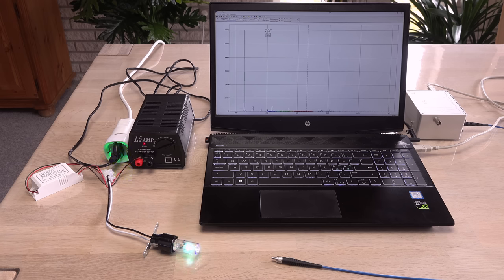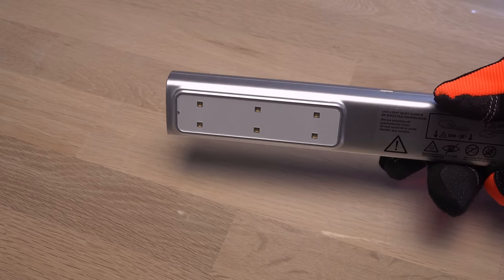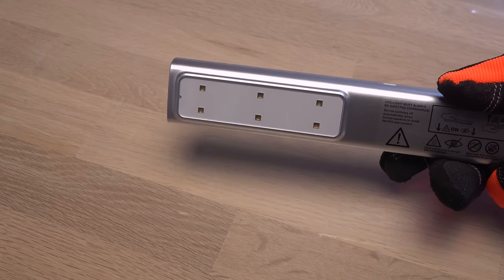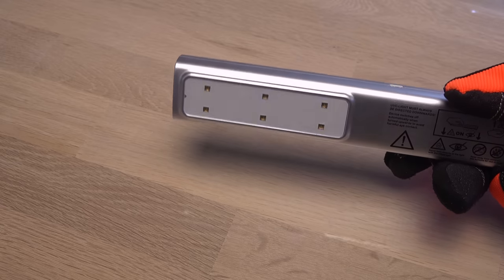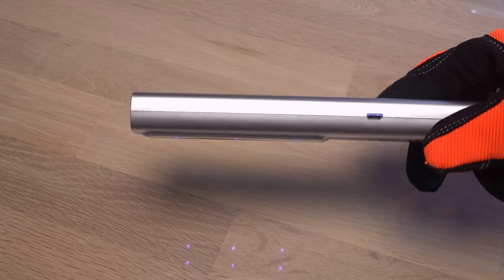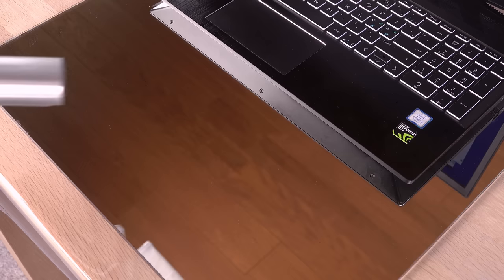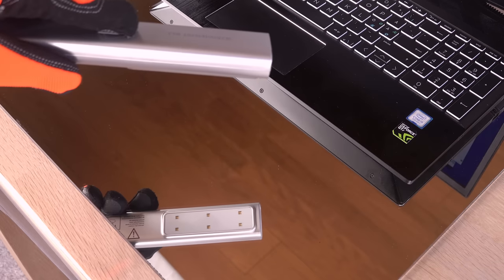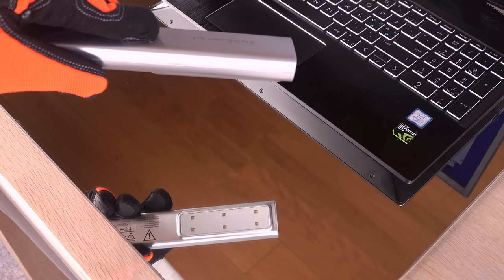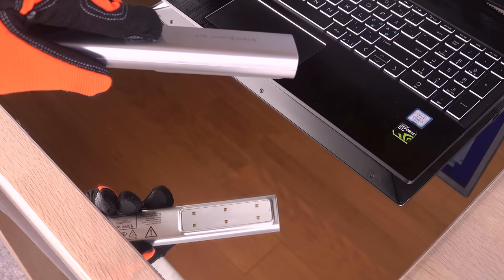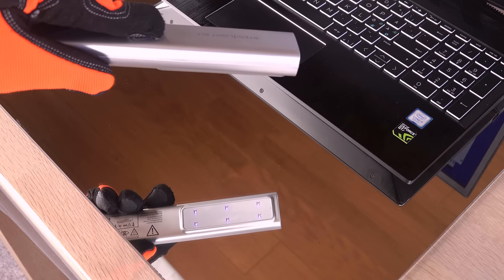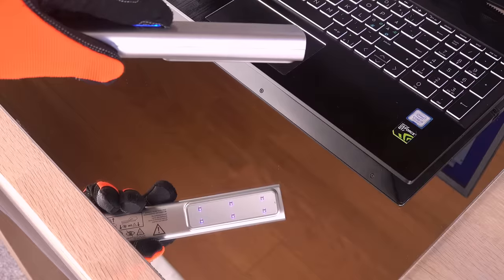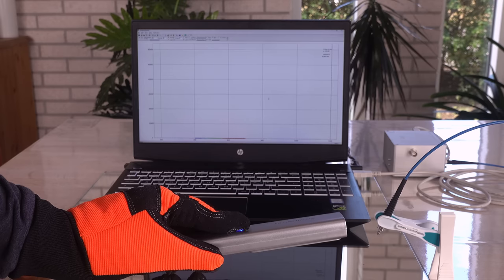The light does turn off if turned upside down. But isn't UVC reflected off surfaces like visible light? Let's start with a likely worst-case scenario: a mirror with its specular aluminum coating, designed to reflect light. It is no surprise it reflects the visible violet well. But what about the invisible ultraviolet C?